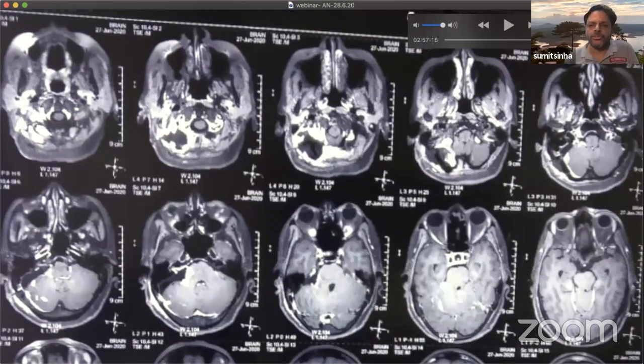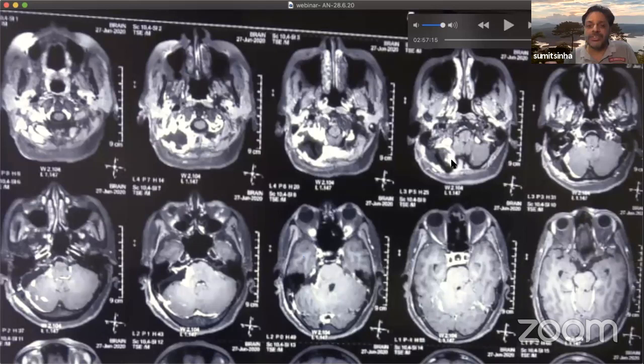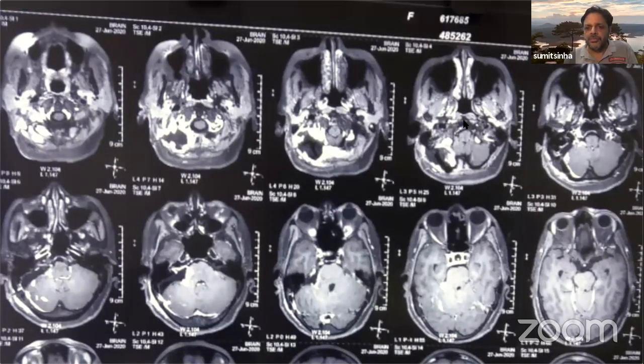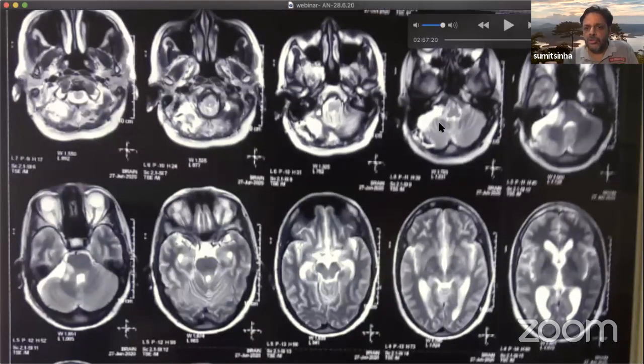If you do the post-operative MRI after 24 to 48 hours, you will see blood traces in your post-op MRI film. So this is not a good time to do it, but I did it because the patient came to me in my follow-up visit. Since it was not done previously, I had to do it as a baseline in order to compare it with future MRI.